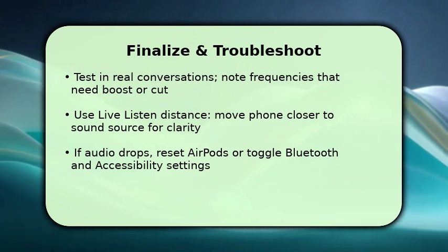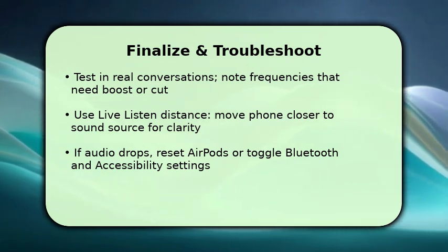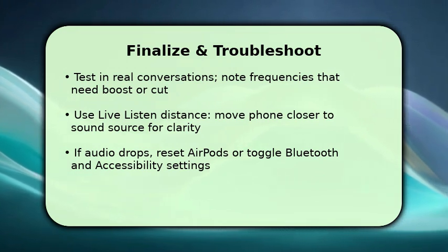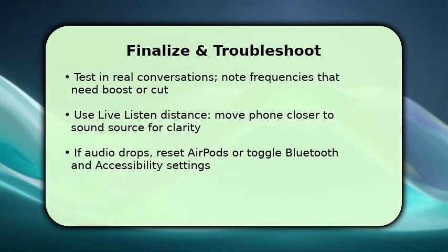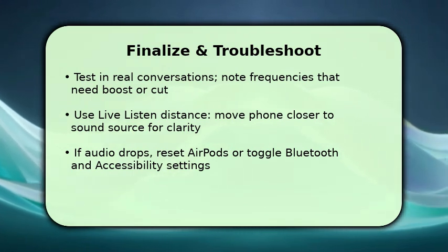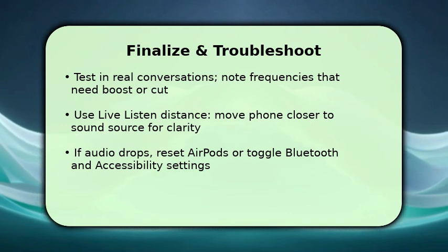If audio stutters or disconnects, restart the AirPods Pro 3, toggle Bluetooth, and re-enable Live Listen. If still failing, reset network settings or unpair and repair AirPods. That typically resolves persistent routing or firmware hiccups.